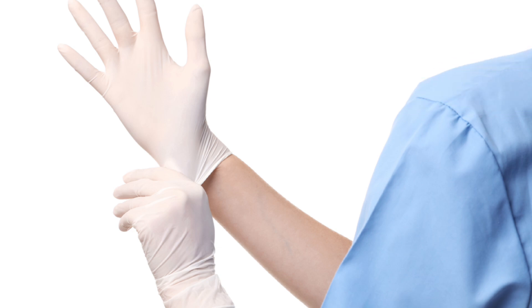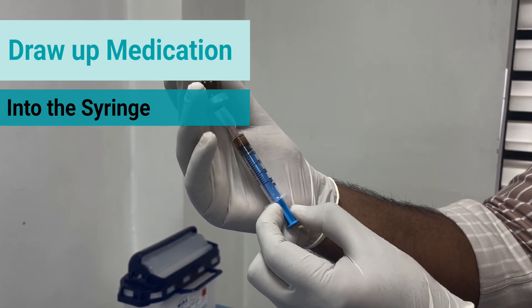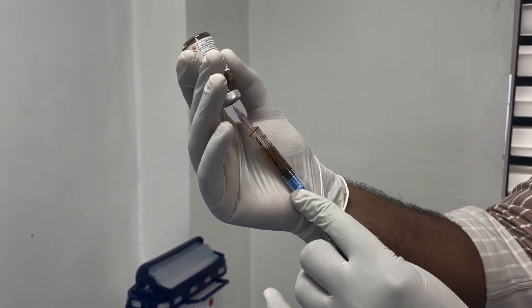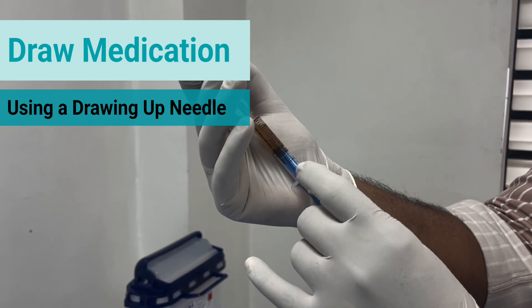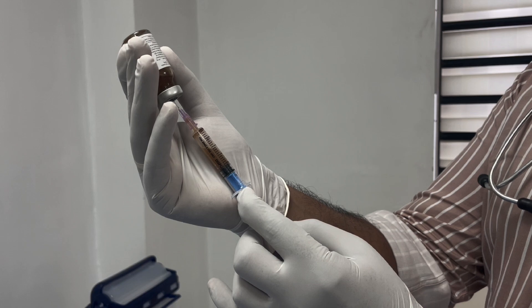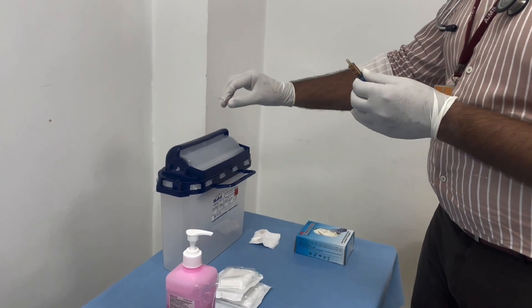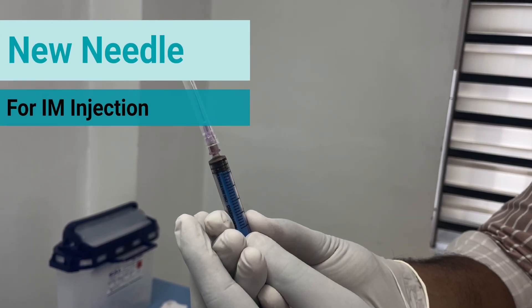Use a drawing needle to draw up the medications into the syringe. Once this is done, the drawing needle is to be discarded into the sharps container. A new needle needs to be attached for the intramuscular injection.